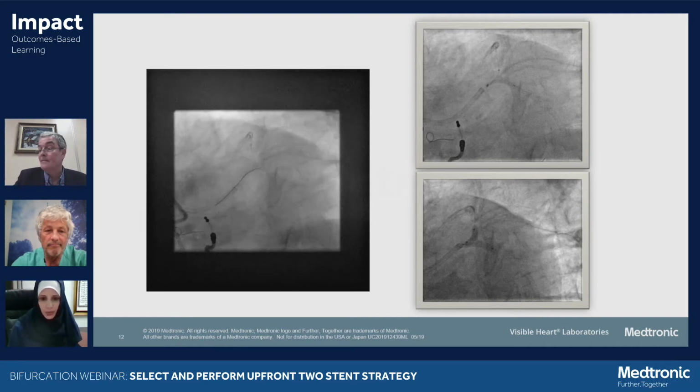So then what you see is we were able to recross into the circumflex. Sorry, Mirvat, there is a question, proximal or distal recrossing. I'm sorry, because there are so many questions coming. Definitely your case is very interesting. So you said central or proximal.